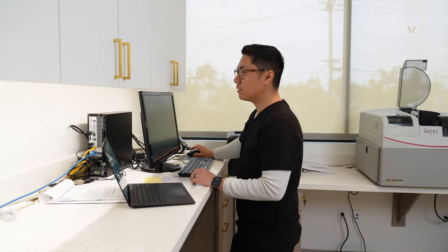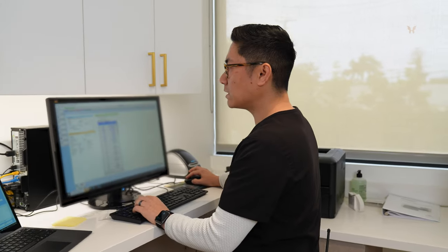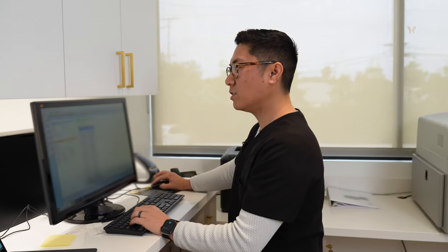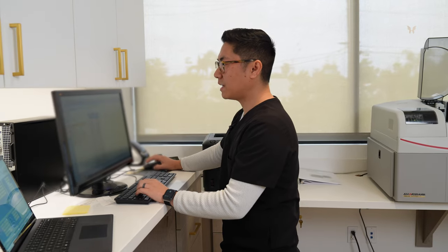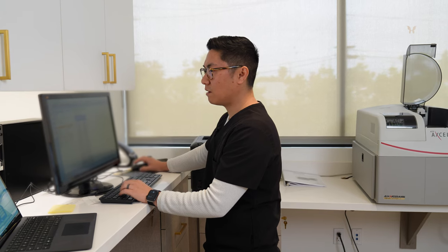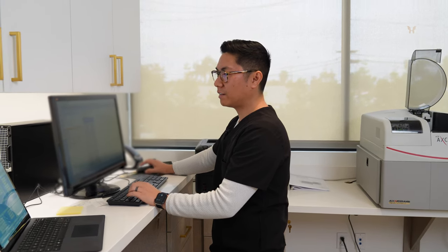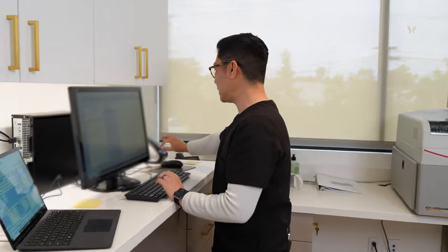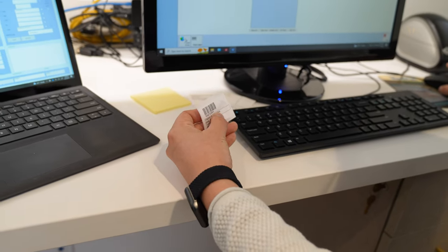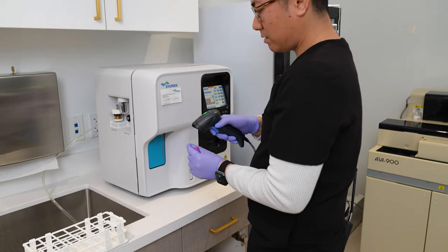Right now I'm putting in an order for lab work for one of our patients. Every patient has their own ID, so there's no confusion — samples won't mix up with other blood. The results will save and back up every week, so we'll have them if they need it right away or later down the line. It's always in their file. Once I put in the order, it prints out a little receipt with a specific barcode, and I can scan it into a machine and it reads it as that specific patient.